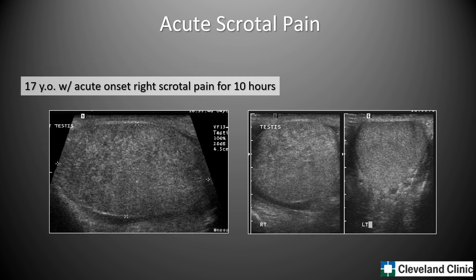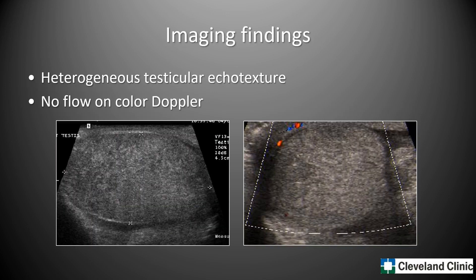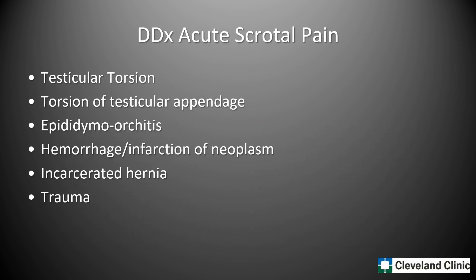The first case is that of a 17-year-old with acute-onset right scrotal pain that has lasted for 10 hours. We see sagittal and transverse images of the right testis with a transverse image of the left testis for comparison. Color Doppler shows no flow within the right testis and normal-appearing flow in the left testis. In summary, we have heterogeneous right testicular echo texture and no flow on color Doppler exam.